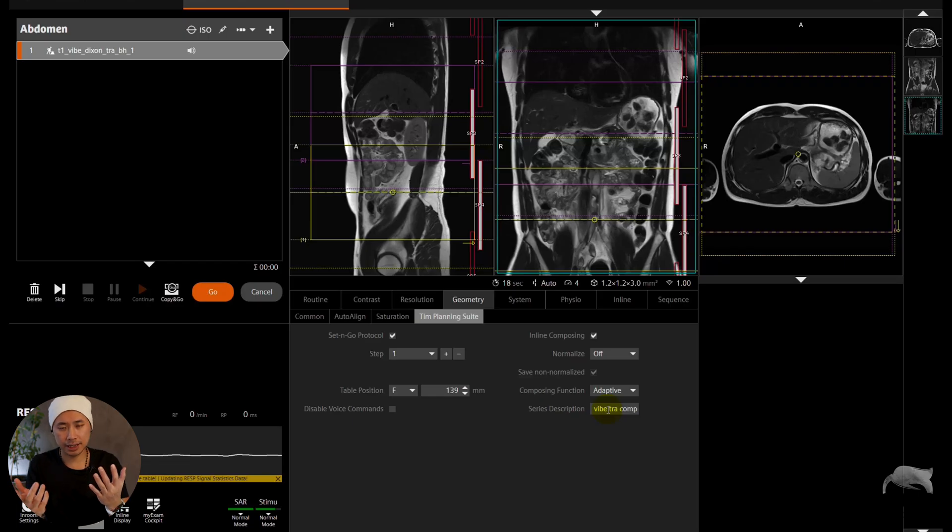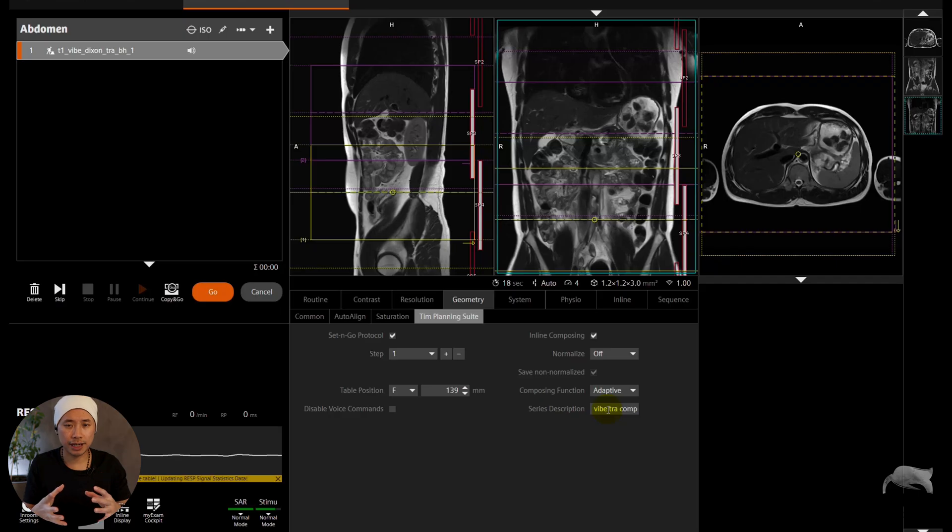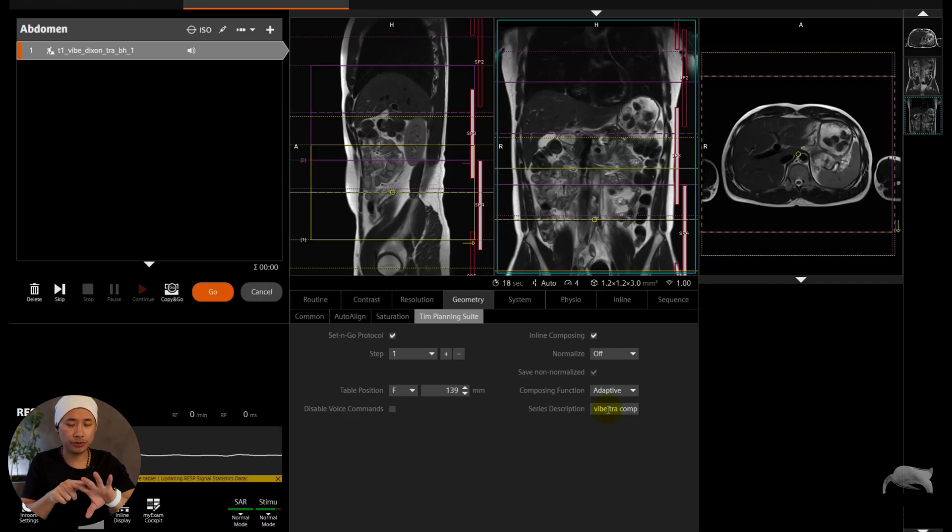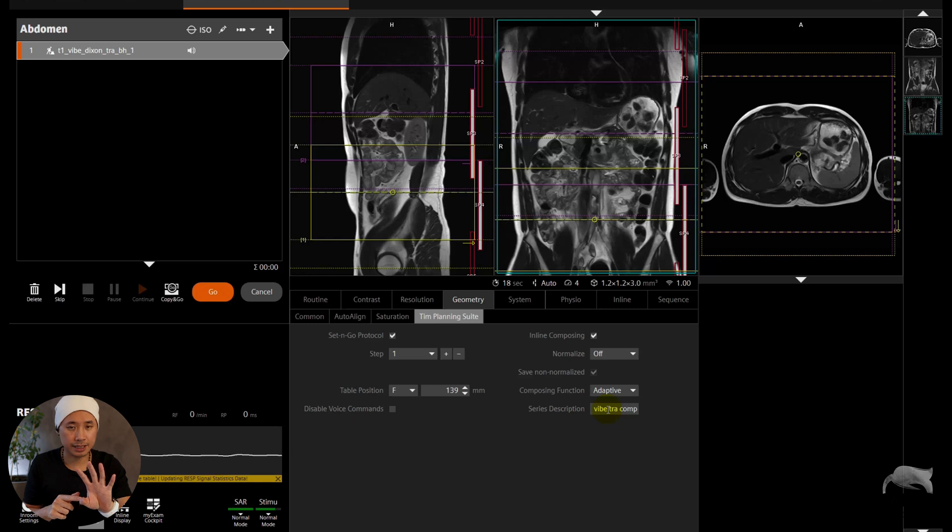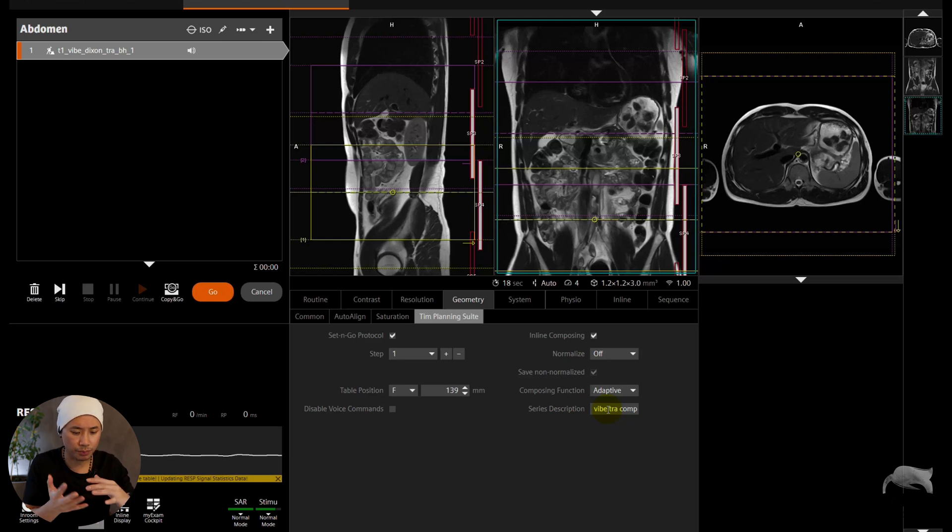And you can name this as T1 VIBE Dixon or whatever, transversal comp, as compose. And whenever the sequence is finished, if you have all the four images like in Dixon—in, out, water, and fat—they will compose together and they will separate for you, four different sequences, right? Different weighted. So it's all composed, it's perfect.